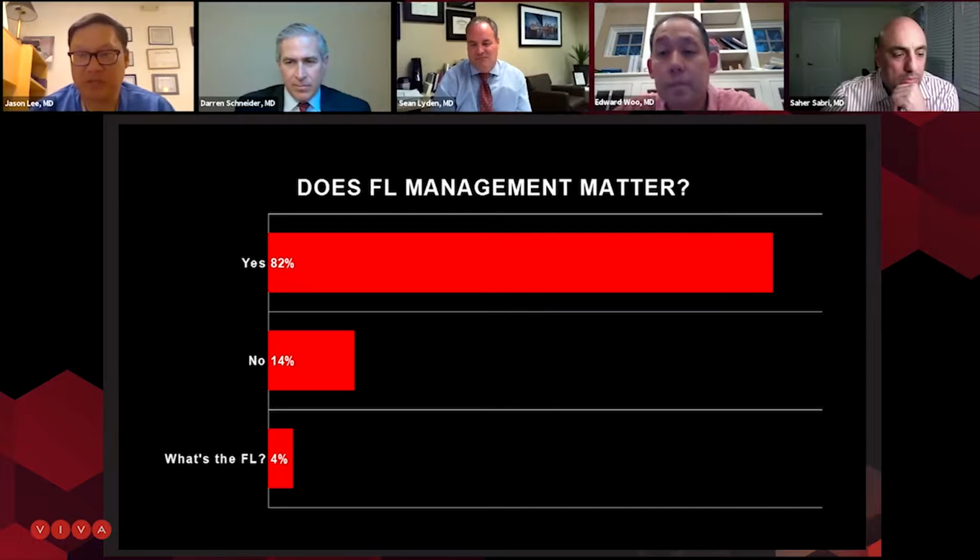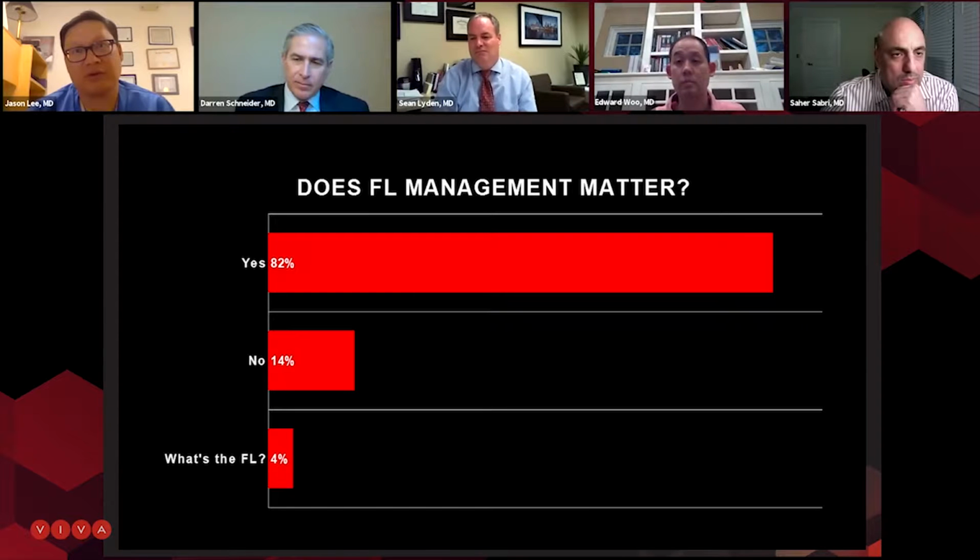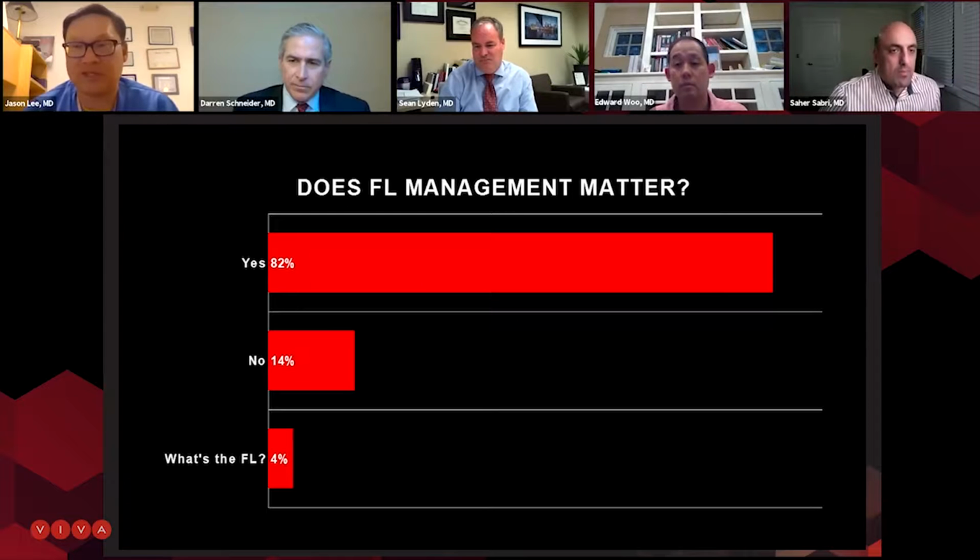We'll actually stage it quite a bit, and so I agree with Ed to bring it down to the celiac, and then often we'll stop and get some imaging and see how much the retrograde flow goes back up. If the false lumen aneurysmal enlargement slows down, or if you think the patient's reliable to follow up, then I think you might be done. If it still persists, then that's a secondary procedure of all the false lumen closure strategies that are out there. But I try not to do it all in one setting. There's probably some spinal cord safety in not 100% obliterating the false lumen.